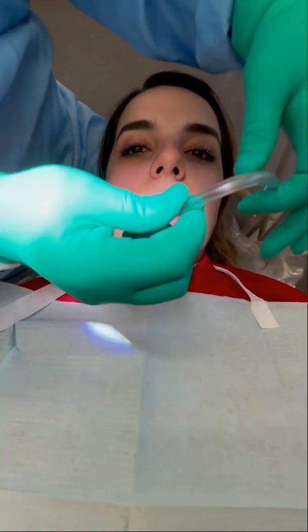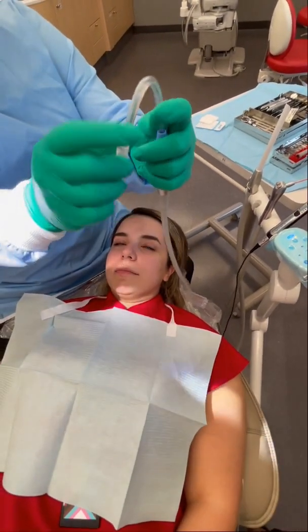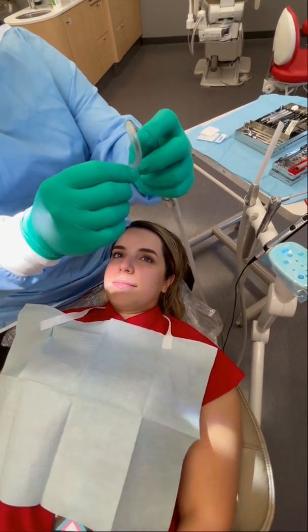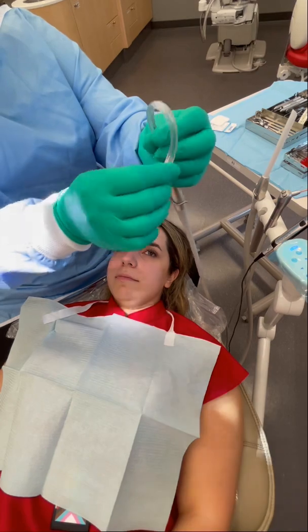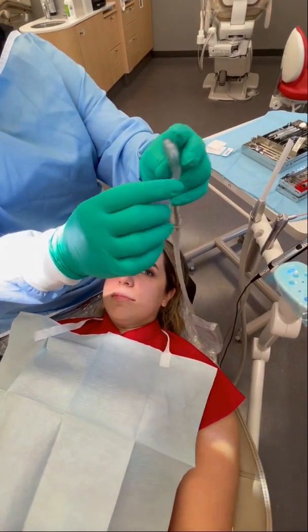So that's what you need. What you're going to do is take this, fold it in half, and then give it a curl. This is going to be for the maxillary. So it looks like a little pigtail almost — it's a curl on this end.